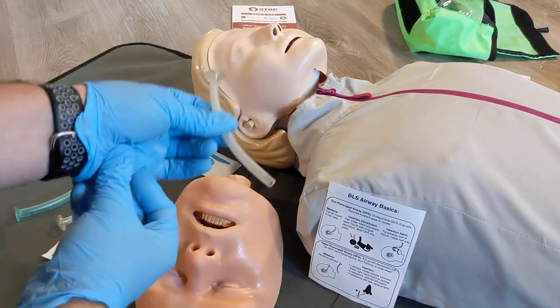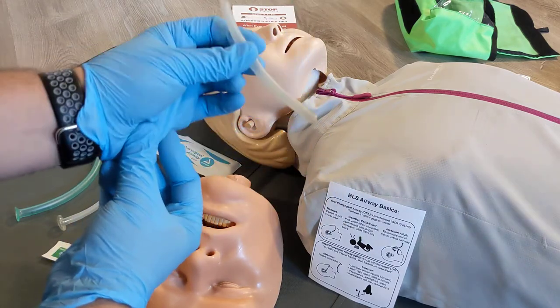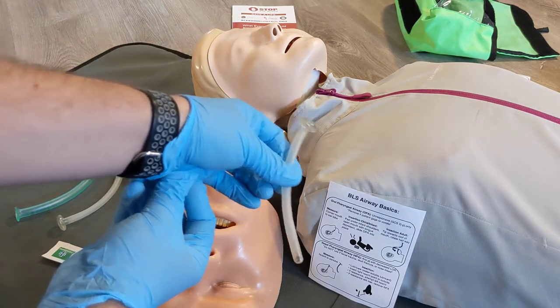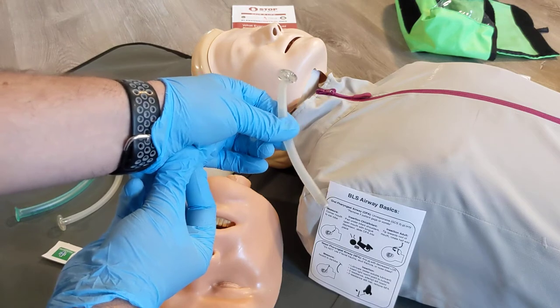So they're unconscious or quite centrally depressed. This is going to assist in getting some air into that patient, in combination with a manual airway maneuver or patient positioning.